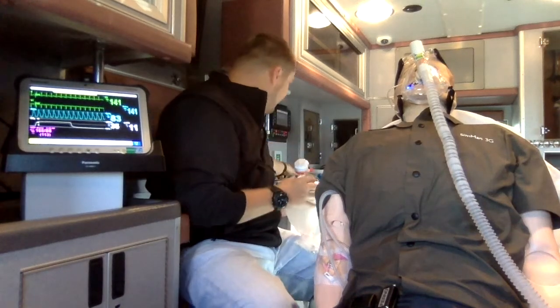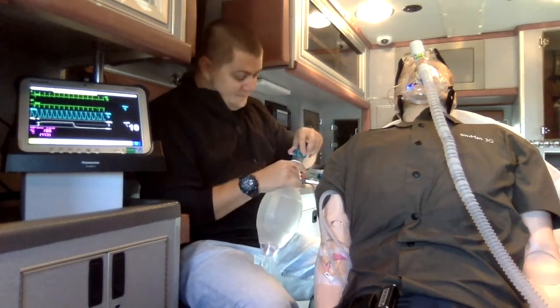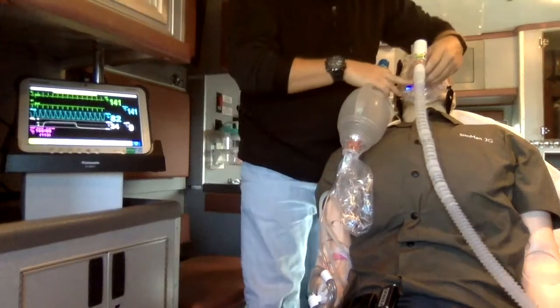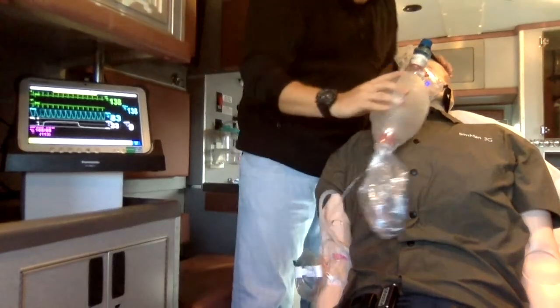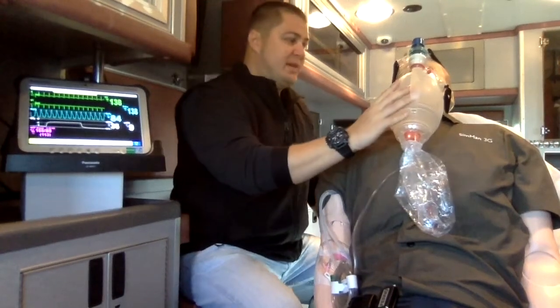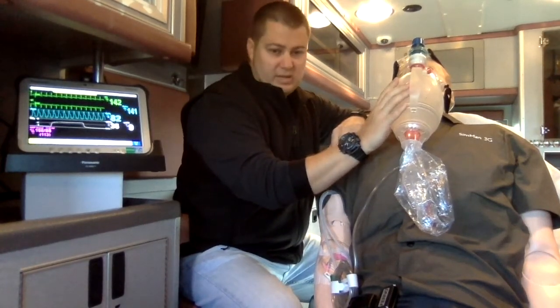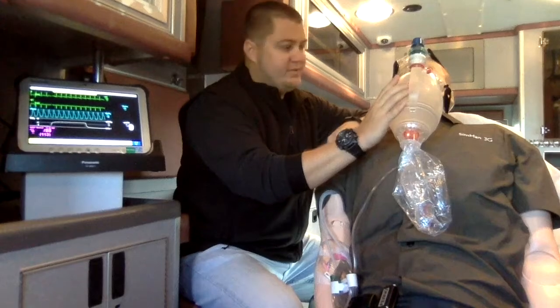I'm going to move to assisting ventilations here with a BVM that I'm also going to add a PEEP valve to. So PEEP valve's applied, 7.5 is dialed in to match what the CPAP was. Patient's going to take one more respiration in. CPAP's been discontinued. BVM is now in place. Still have PEEP, so I still have airway recruitment and the ability to splint open the lower airways. So we're going to assist his ventilations at a rate of 8, and then probably give him some full mandatory ventilations to equal about a 10 to 12 to 15 range for respiratory rate here.